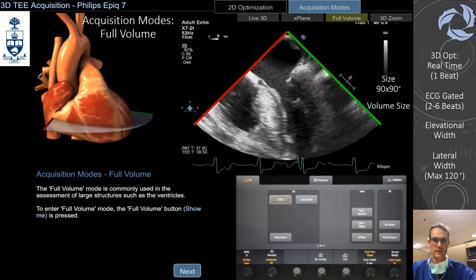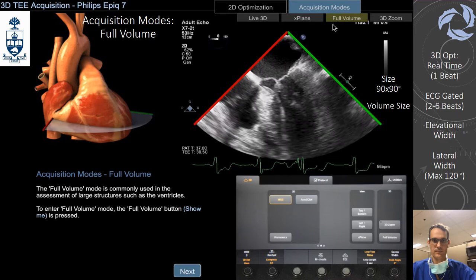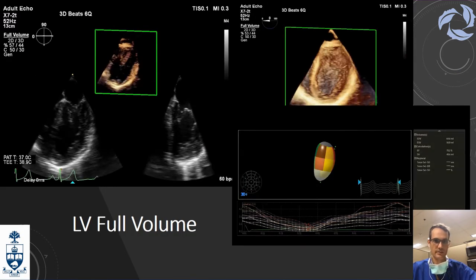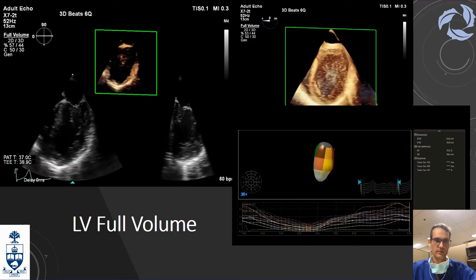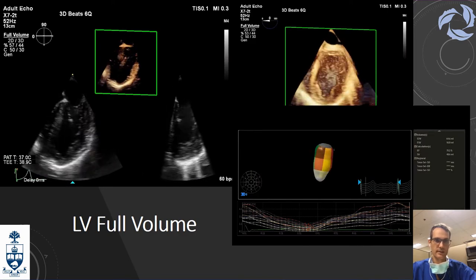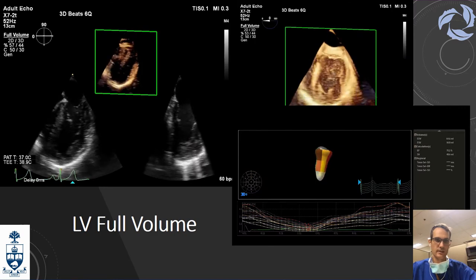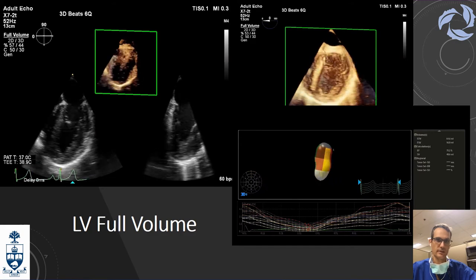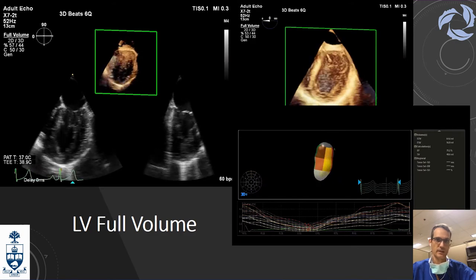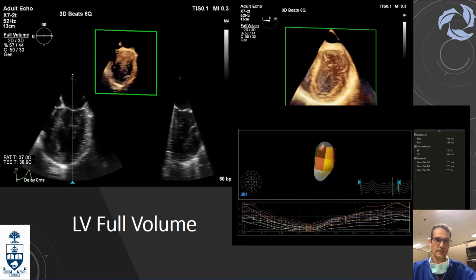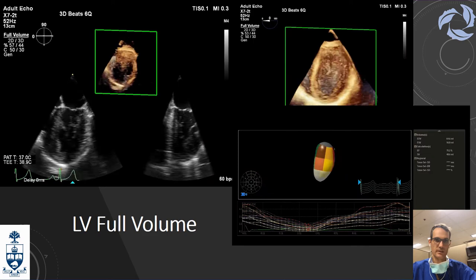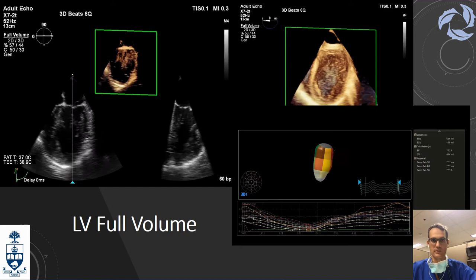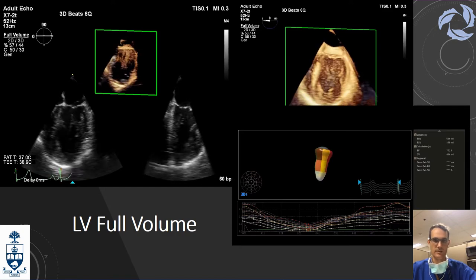Those are examples of LV full volume. When you have those three images, you can go to the tactile screen and select only the 3D image. I normally recommend you have the multi-plane view so you know you are not foreshortening your left ventricle. You can increment your size and generate an image, then using 3D QA Advanced you are able to generate a 3D ejection fraction of the left ventricle.